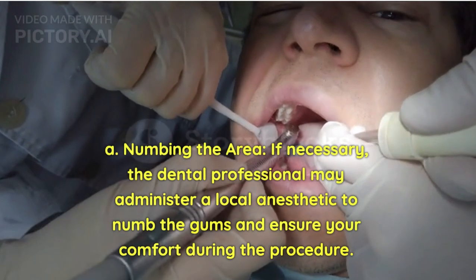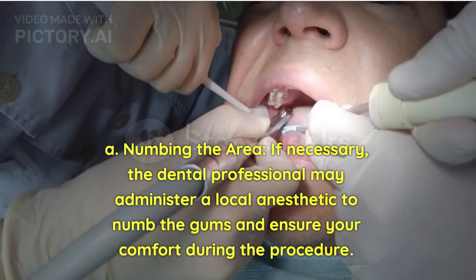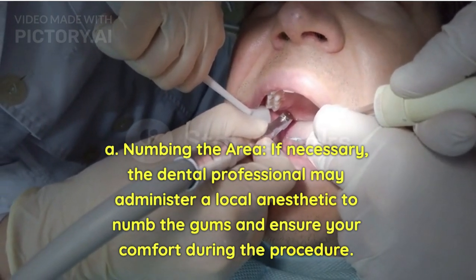Numbing the area: If necessary, the dental professional may administer a local anesthetic to numb the gums and ensure your comfort during the procedure.